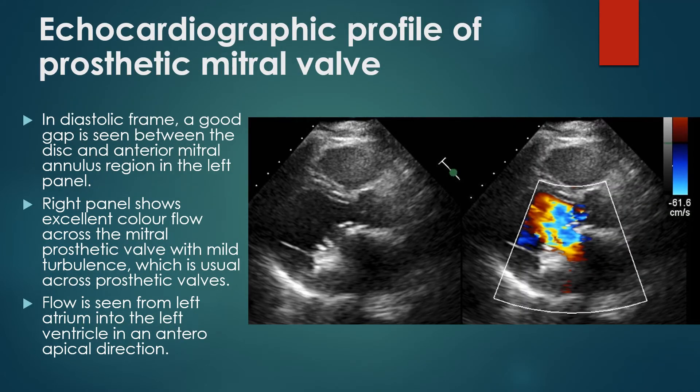A good gap is seen between the disc and the anterior mitral annulus region in the left panel. The right panel shows excellent colour flow across the prosthetic mitral valve with mild turbulence, which is usual across a prosthetic valve. Flow is seen from the left atrium to the left ventricle in an anteroapical direction.